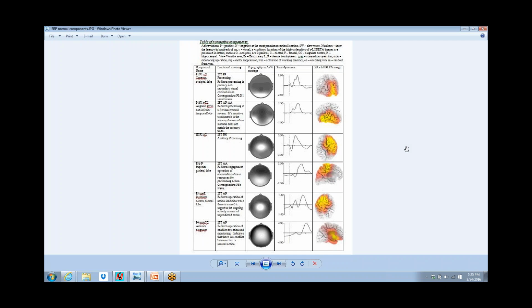Not at 10,000 each group, but 10,000 total in a bunch of different clinical groups. The Russian database obviously has norms as well, the HBI database, and that database is now being replicated in Korea. They have 800 norms collected on their way to 2,000, 1,000 male, 1,000 female.